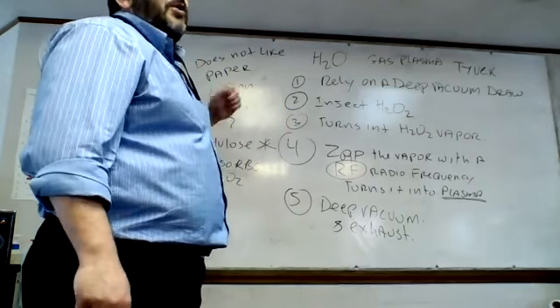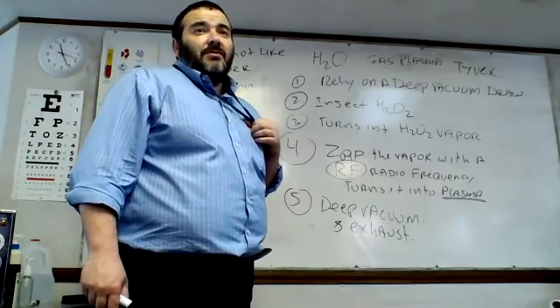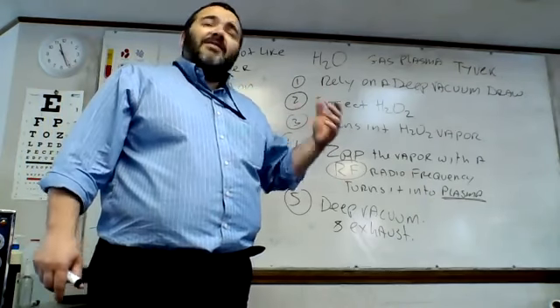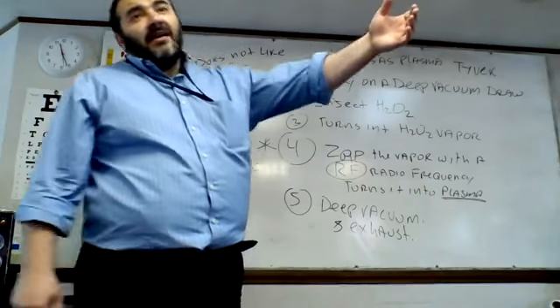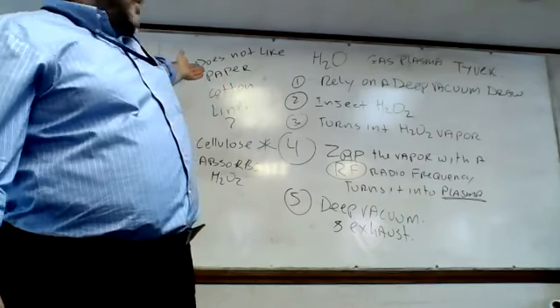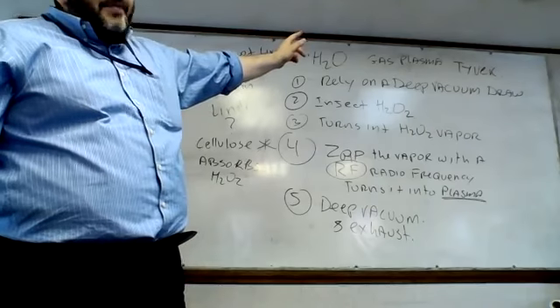Believe me when I tell you, this is going to be on the National Board examination, I assure you. Okay, so, low temp, kills by oxidation, does not leave a toxic residue, doesn't take so long, but conversely, doesn't like all the packaging materials. Our favorite ones, paper, cotton, linen, we don't like, we only like Tyvek, all right?